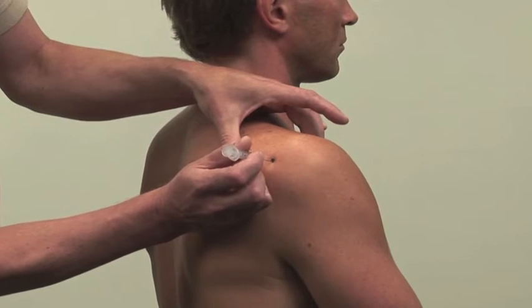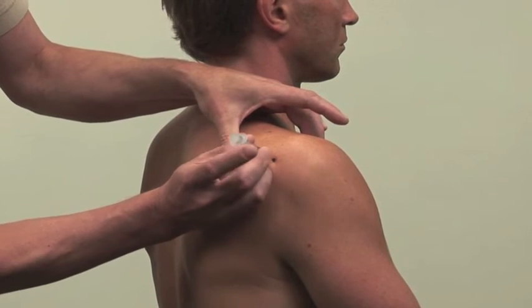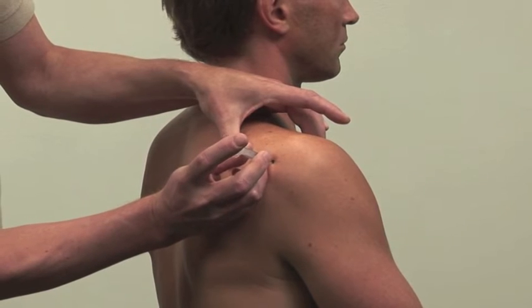Back up the needle a millimeter or two, then inject the solution as a bolus.